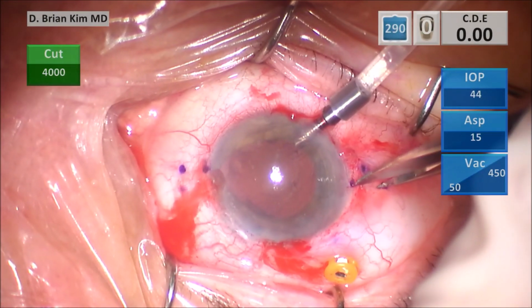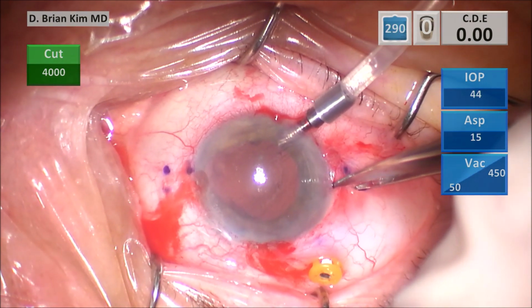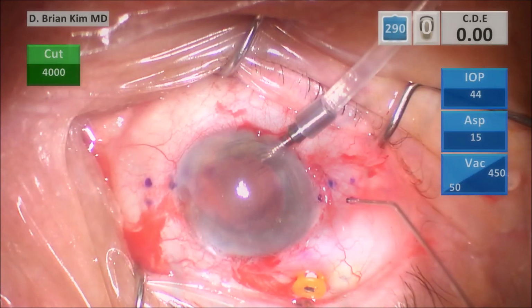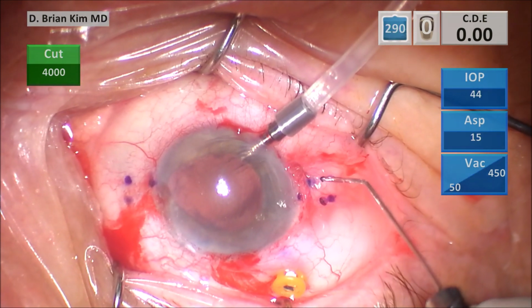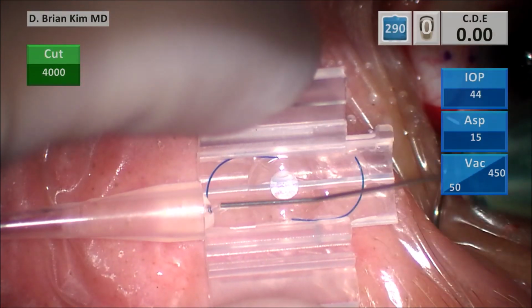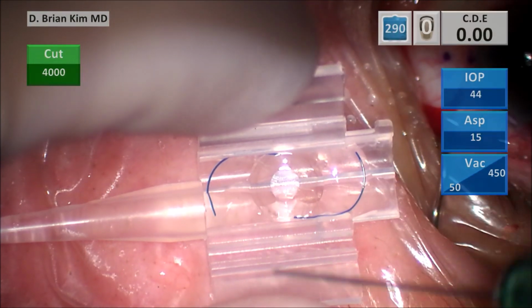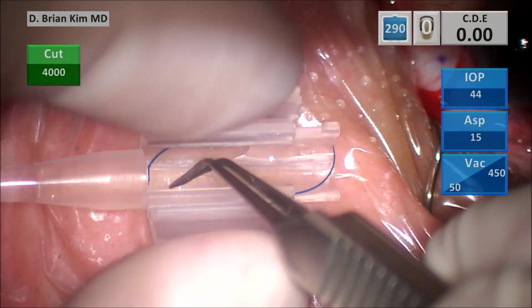Here what you can see is after some manipulation, the mark actually moved. And so again, going back to what I've always said, the conjunctiva is a mobile structure, and you always have to reassess whether or not the conjunctival mark reflects where you want to place the needles through the sclera. And so this is my lens. I like to make sure that I load the lens myself when I'm doing the Yamane technique.